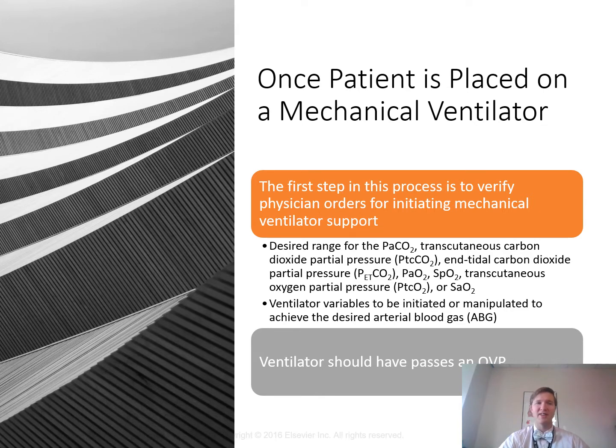When we're looking at this, we're going to look at documentation of how the patient's doing with the ventilator interaction. After they've been placed on the ventilator, we need to document what's going on. What were their peak pressures? What were their plateau pressures? What was their heart rate? What were their breath sounds? We need to trend these things, and we need to communicate these things as well. So not only do we use our charting for trending, but we also use it as a method of communication, and it helps us see how the patient is progressing, or how the disease that the patient happens to have is progressing.